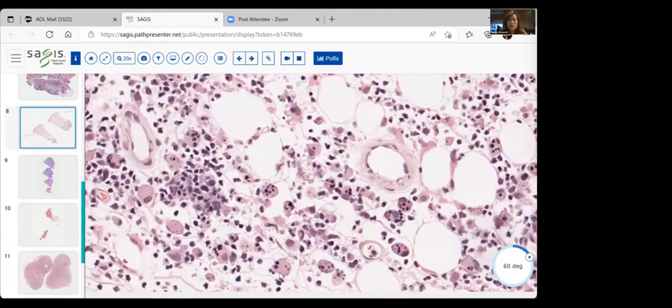Do you know what these cells are? These are called beanbag cells. These beanbag cells are cells that are filled with inflammatory cells. They could be lymphocytes, they can be neutrophils, they can actually even be erythrocytes. These will eat those up. And unfortunately, they take them up into their lysosomes and they grind them down, and so you see debris. You see how there's little pieces of cells in here? So what's happening is these histiocytes are gobbling all these inflammatory cells up.